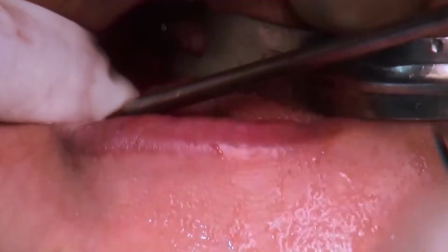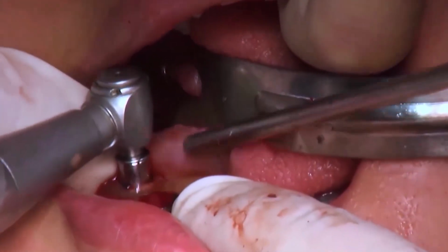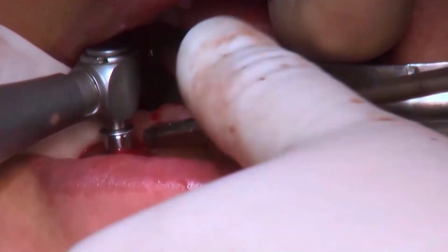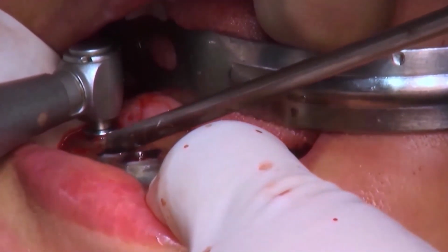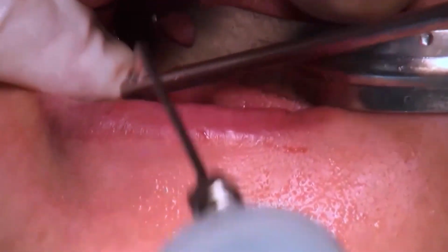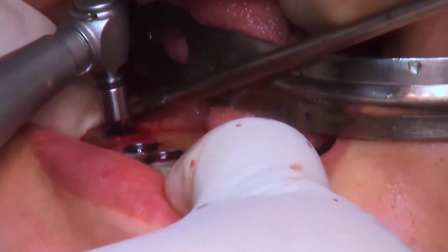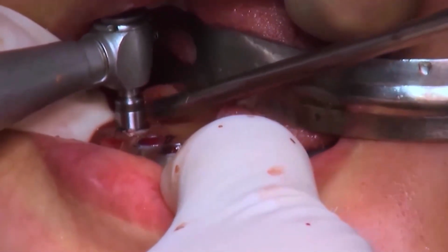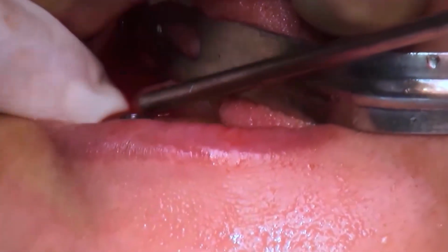We are increasing the length and diameter gradually. This is a bone profile drill. You can control the depth of the drill using the marker.